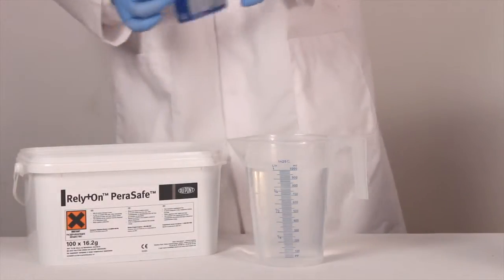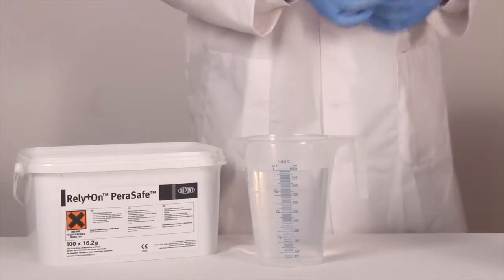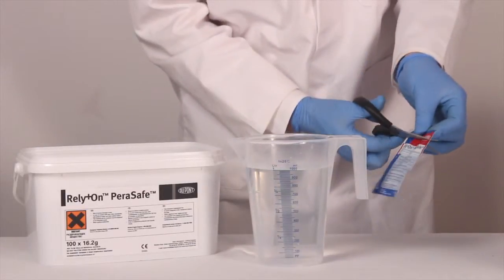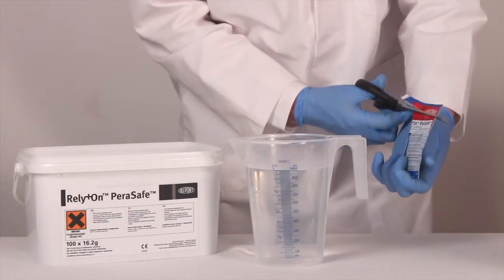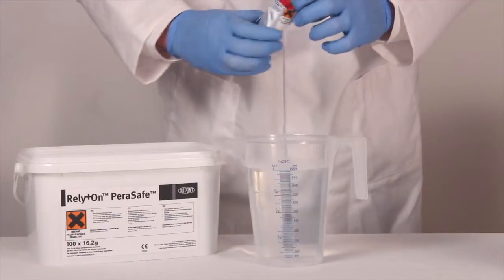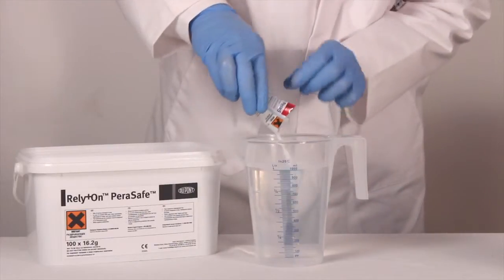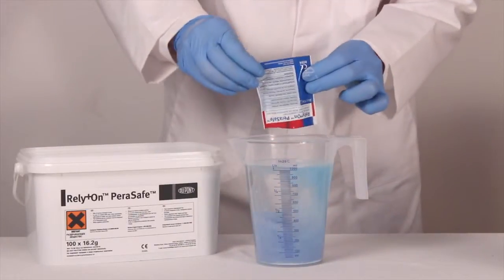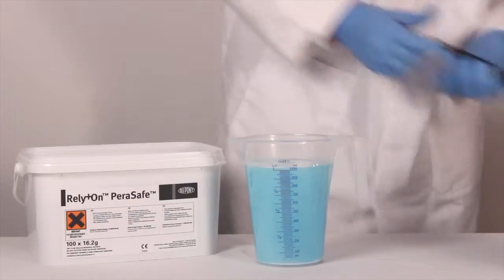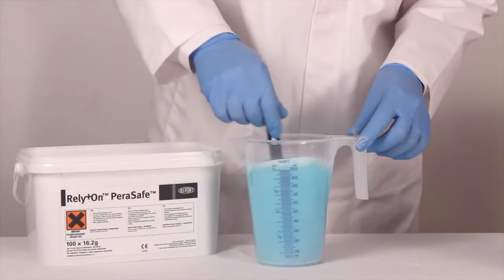Take the sachet and carefully cut open. Then pour the powder into the lukewarm water. And finally, mix thoroughly until fully dissolved.